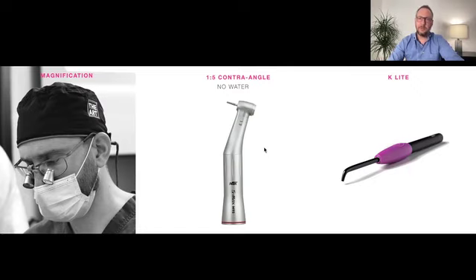And what he's recommending, and something that I really like also to recommend to you: first, don't miss the opportunity to use magnification. I know this is an investment, but it's an investment for us and for our patient. And this is something that orthodontists need to start using more and more, magnification glasses. This will open a lot of new windows for you to understand attachments, if they are well bonded, if we need a lot of access, and how much we need to remove.